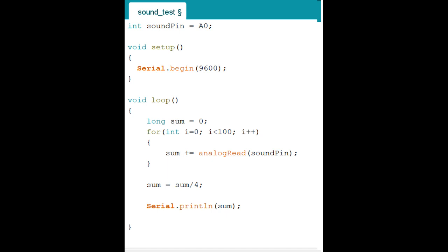Okay, if you remember, I said the A0, A1, A2, A3, A4, A5, it's all different pin, and we have to assign the pin, and then we have to communicate to the computer, hey, I'm going to use A0, I'm going to use A1, I'm going to use A2, things like that. So what is the first line so far is telling me? Okay, I'm going to put the pin connecting my mic to A0. Okay, so let's say I connected my mic to A1 and then call software A0.